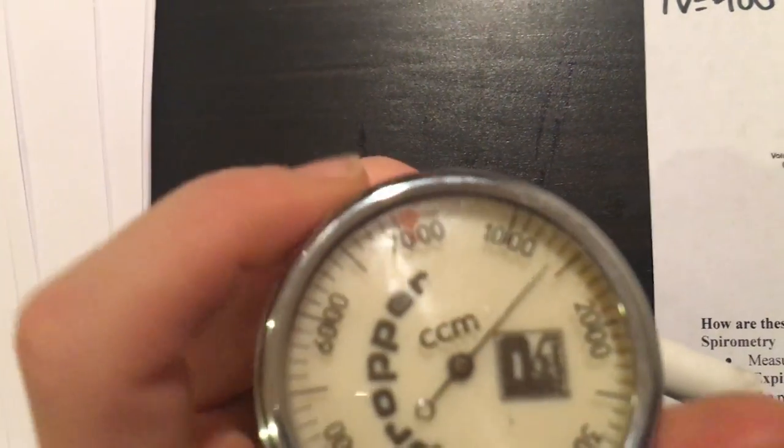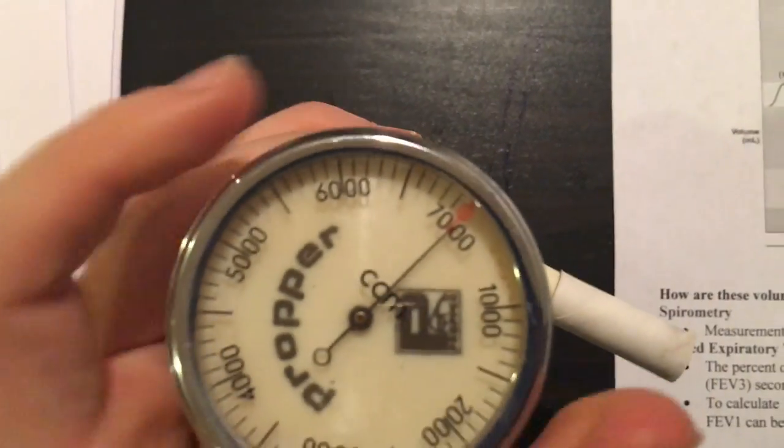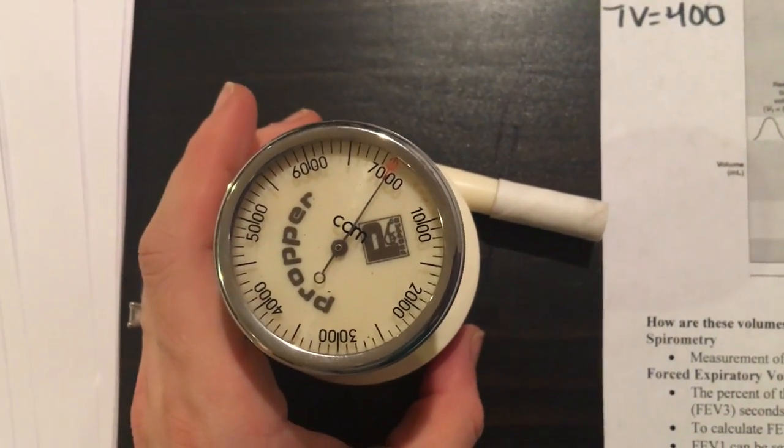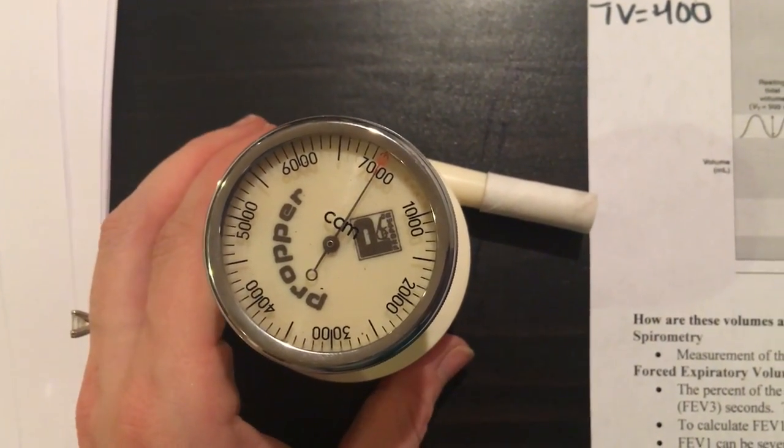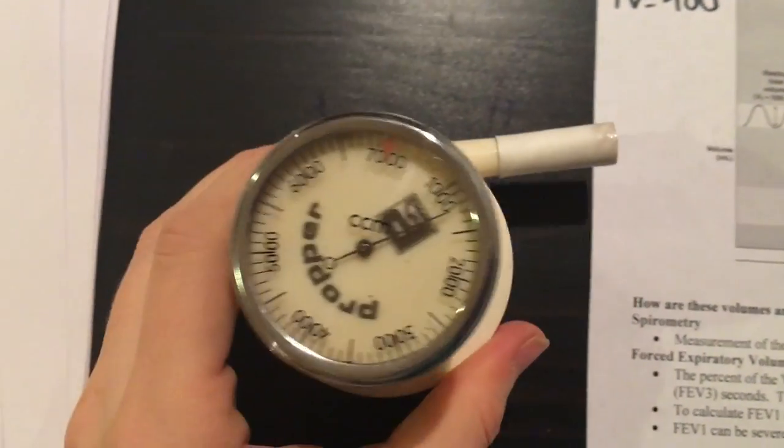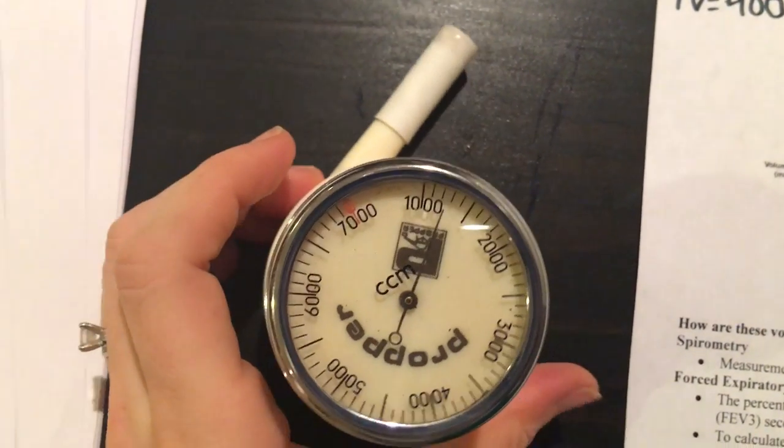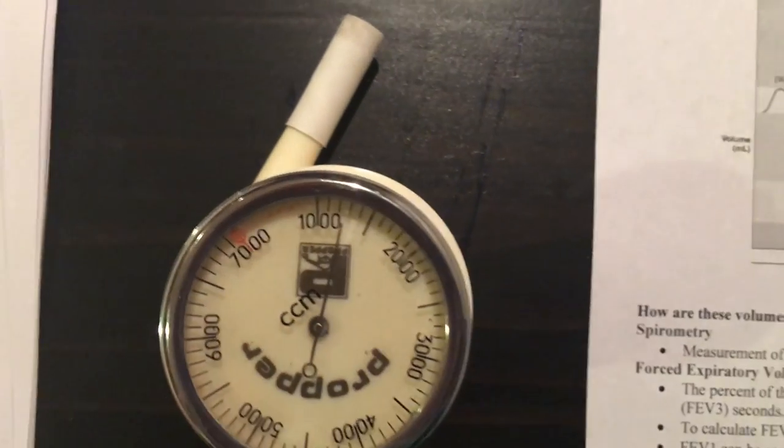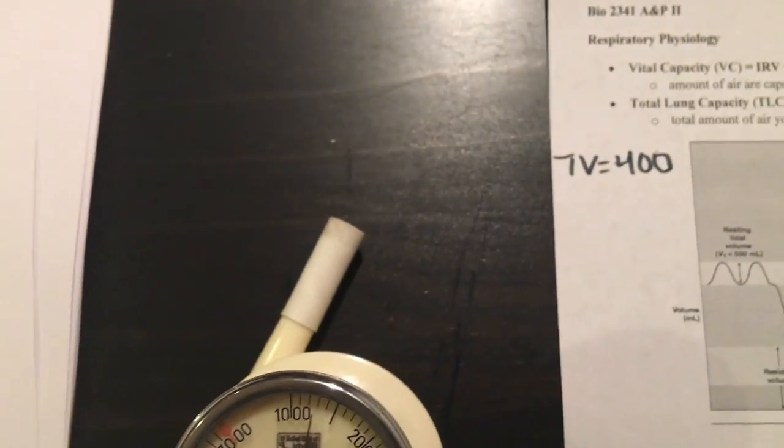I'm going to reset this. I'm going to set it to zero now, right on the zero. I'm going to take a normal breath and then I'm going to exhale forcefully. So here we go, let's see what we get. Okay, so that looks to be about 1200 milliliters.